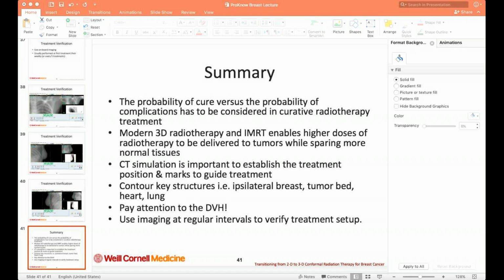And then, is there a minimum extent to which you can hypofractionate? For instance, is there any such thing as a single fraction breast treatment or something? Like, to what extent can you hypofractionate? So that's my question. And then the economic implication as well.